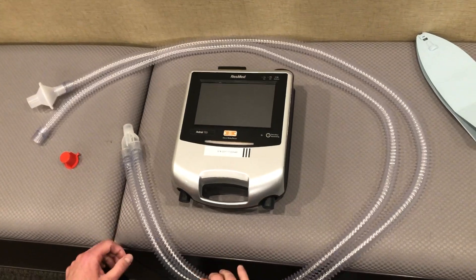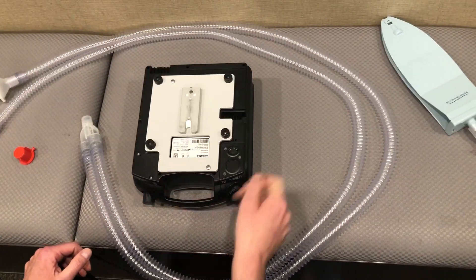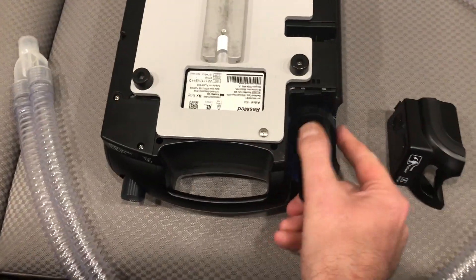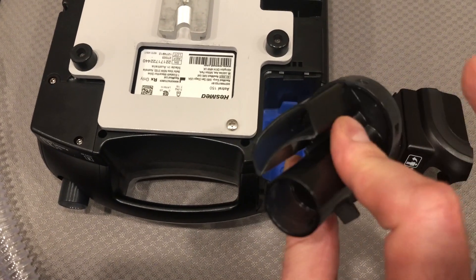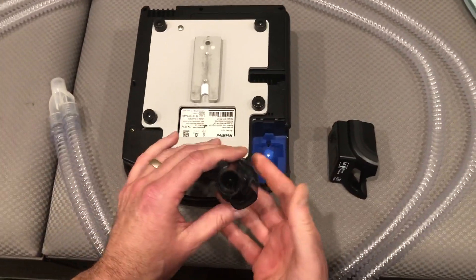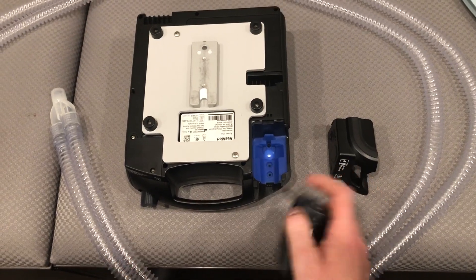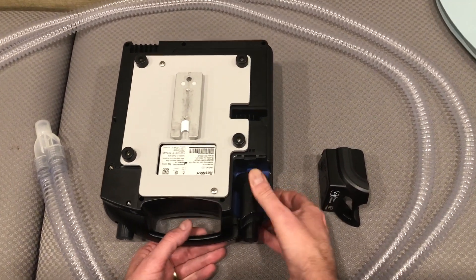The first thing we want to do is turn the machine over and make sure that we have the proper insert. You can see that this is a double limb insert — it's open, has two openings and two channels, along with male ends that are going to fit in the grooves right there.